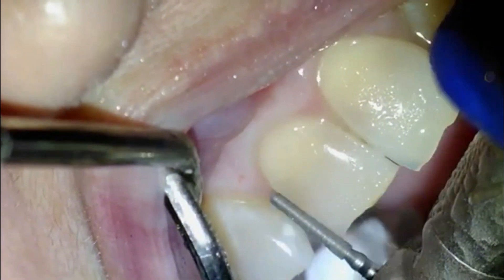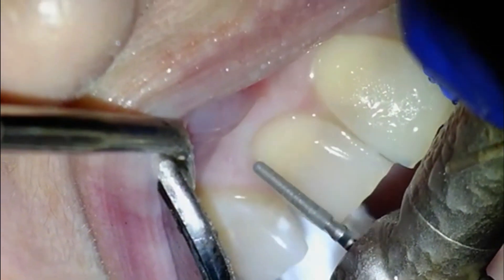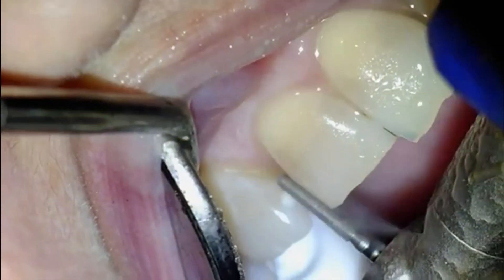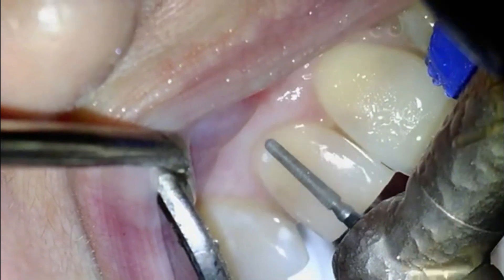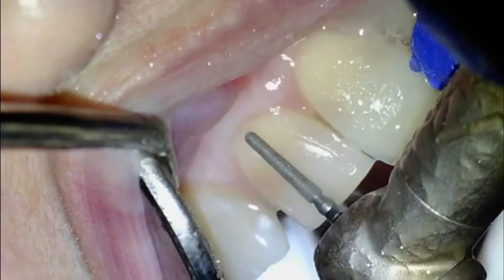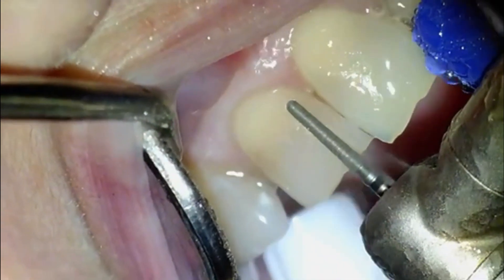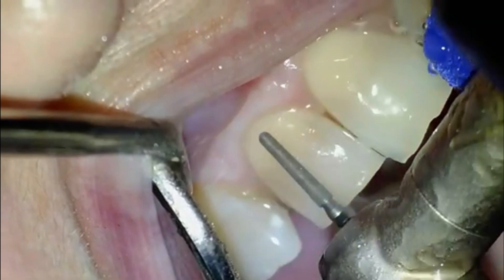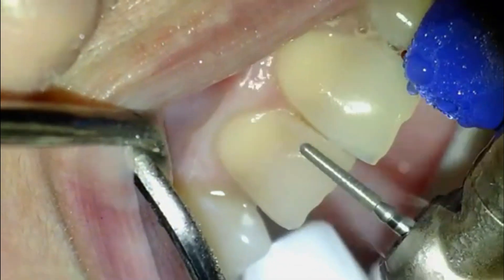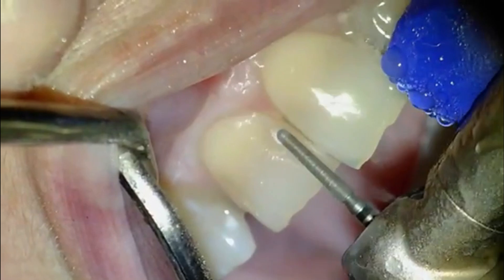She also has a little bit of what looks to be tetracycline staining — that grayish band in the middle of the teeth. You'll see it a little bit more as we remove more structure. Zirconia is going to opaque that out a little bit; it's going to be a little bit better at blocking that out. The reason we're doing these crowns is that the backs of them have been completely worn away with acid erosion. This patient suffers from GERD.